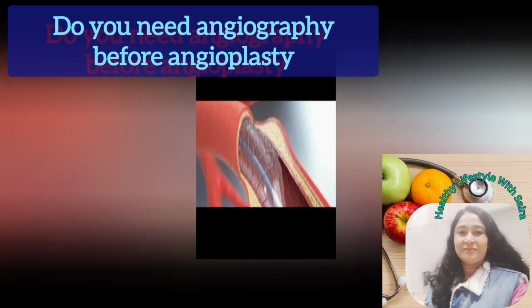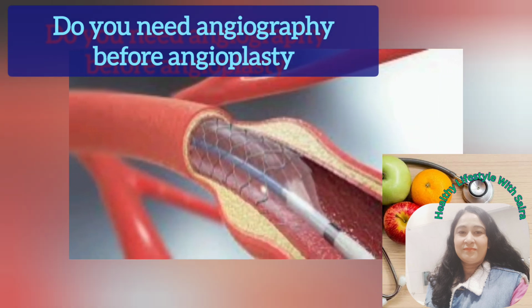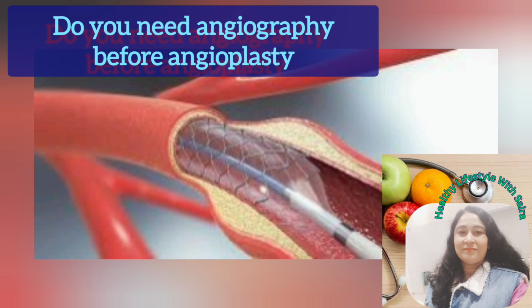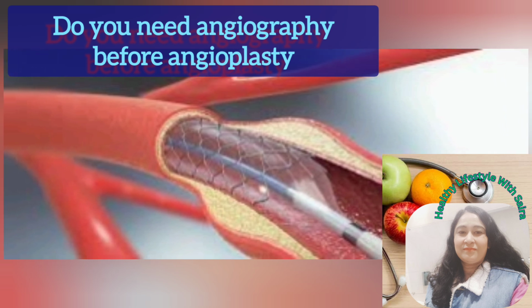Many people ask the question, do we need an angiography before angioplasty? Yes, your doctor can prescribe an angiogram to view the arteries of your heart. They use it to gather images that show them where blockages are located in your arteries. If they find blockages, angioplasty is one treatment option. Your angiogram may progress to an angioplasty in the same visit.